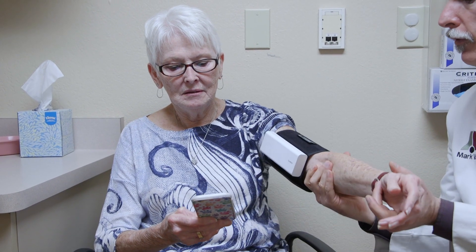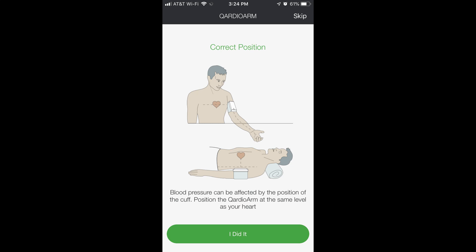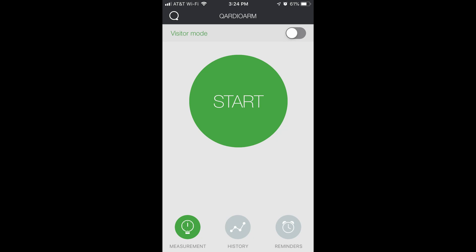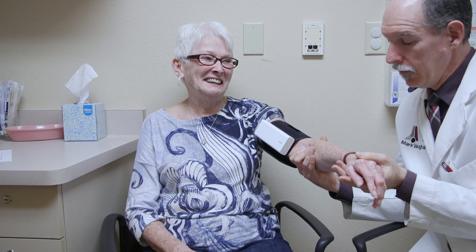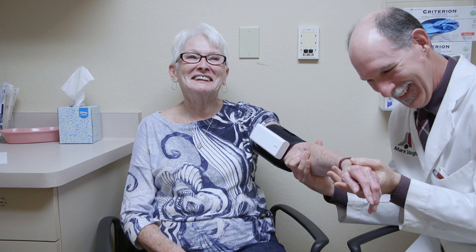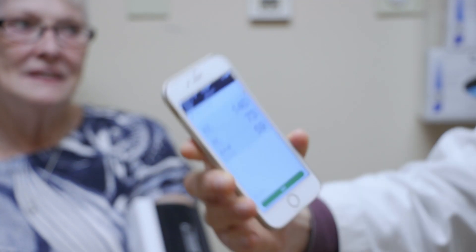Now it wants to do a blood pressure reading. It tells you to get in position — rest your arm. Then hit the gigantic green button. You're not supposed to talk during the reading.